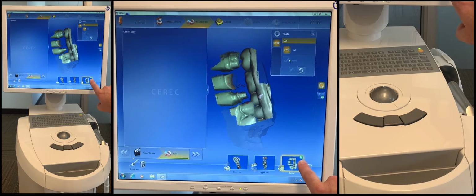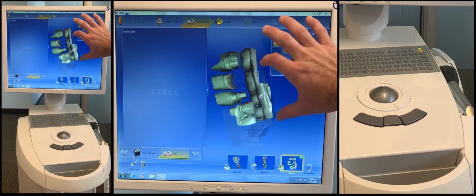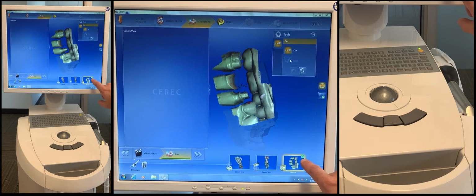But if you look at this, there's a little green checkbox. This checkbox is really critical at this step. If you don't have this checkbox highlighted, you either don't have enough common data in between these two image sets, or your buccal scan is not clear enough. So make sure when you're doing your imaging, you end up at this stage with a green check mark.